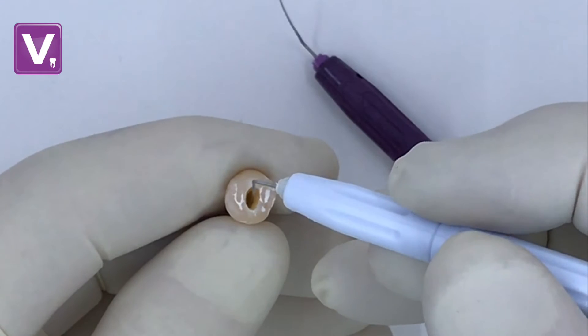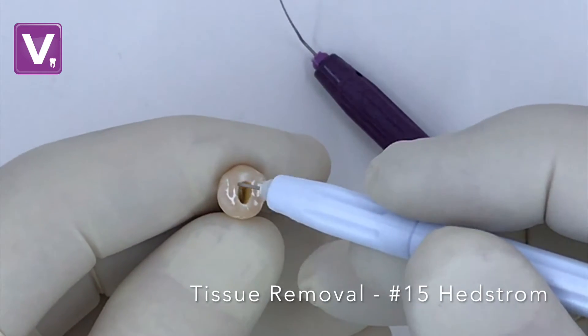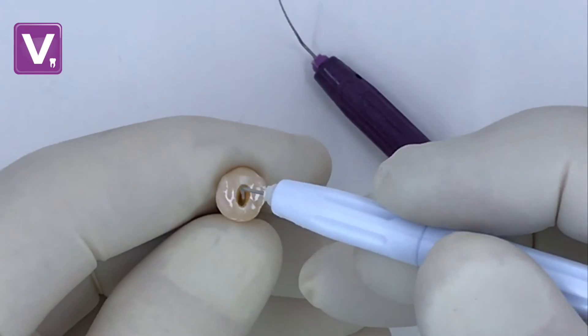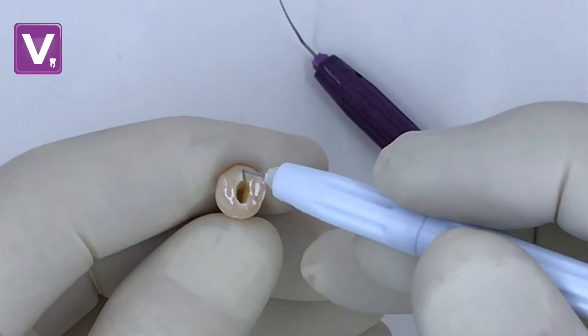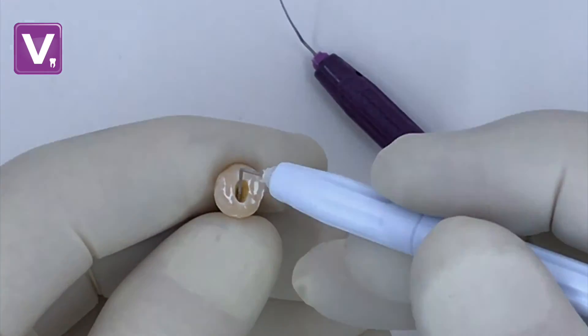Next Step: Tissue Removal. With the pulp chamber full of irrigation solution, a small Hedstrom file is used in the same up-down filing motion around the canal orifice in a circumferential pattern. This lifts tissue up and out of the canal and is removed with irrigation.